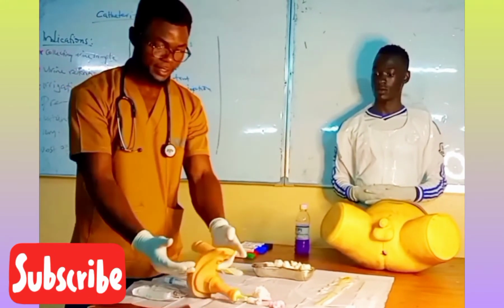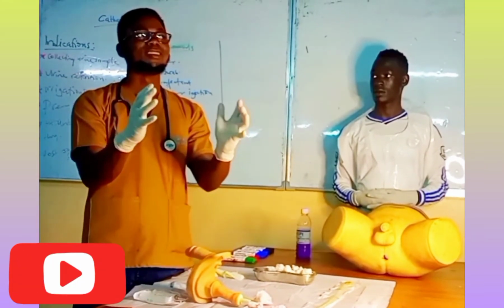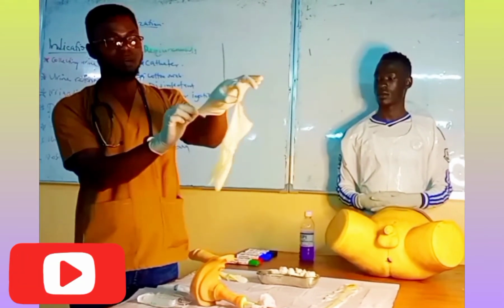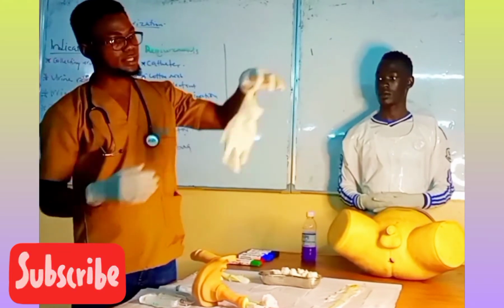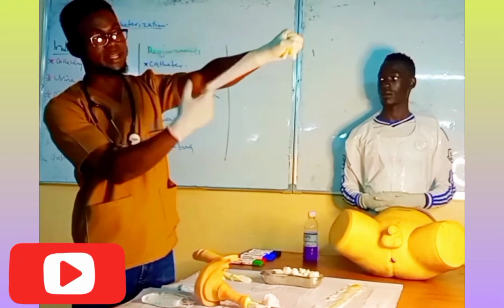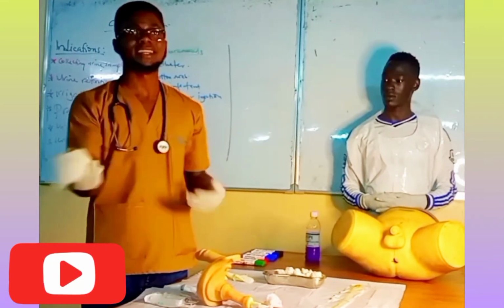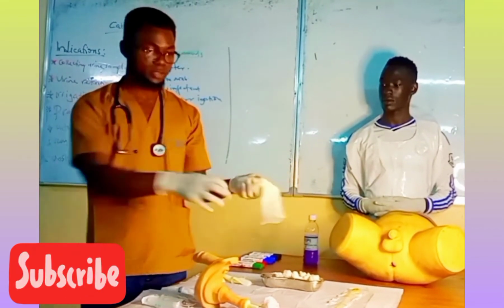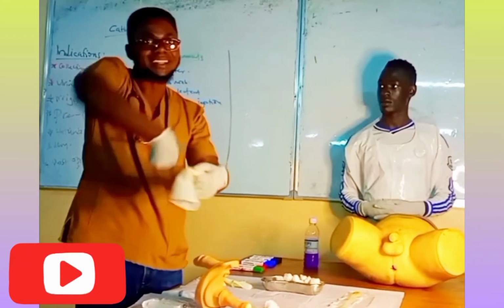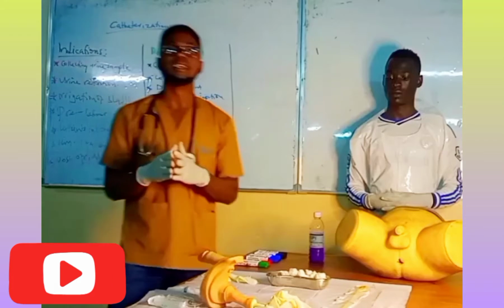When I'm done disinfecting, the gloves I've been using are contaminated. So what do I do? When I'm discarding, I first remove this one, then this one, making sure I hold it very well. Then I hold by the neck and put it inside. Even if I drop them there, even if I touch them, I cannot pick up the infections. Why? Because of the surface I've been using. Okay, now I'm ready for the next part.